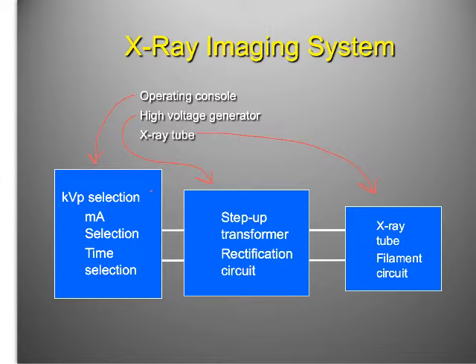And finally, the last step is the X-ray tube itself. And it is going to be on what we call the filament circuit. And so if you can see, that's illustration K on figure 8.1. That is a step-down transformer. And so it has fewer secondary turns. It's a step-down transformer, so there are fewer turns on the right-hand side. Can you see how the wire has fewer windings on the right-hand side? That's important.